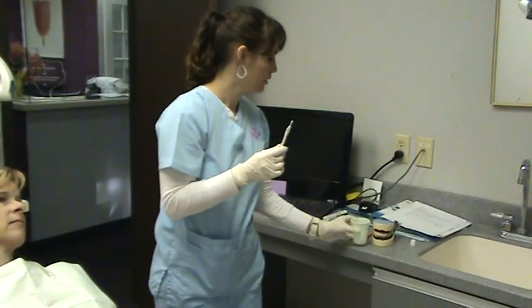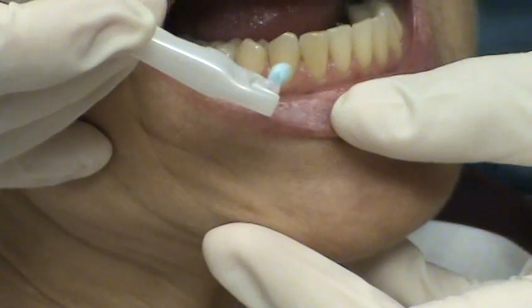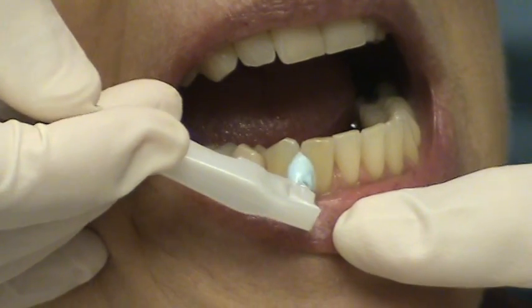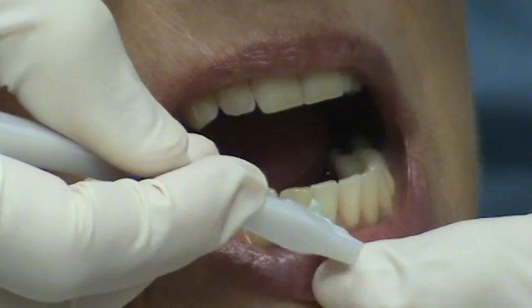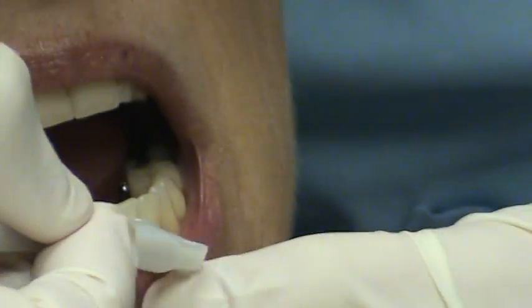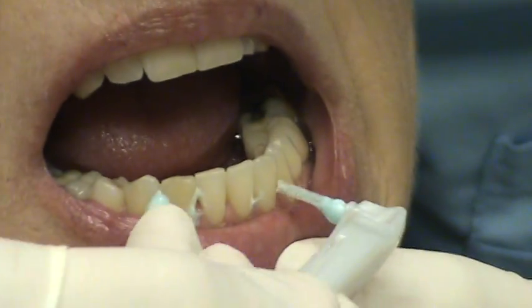Once you have your toothpaste, then you put it between the teeth and you use it like a scrubber. Scrub the plaque from between the spaces from the outside going in. If it doesn't fit, don't force it through — move on to the next spot. You do all the areas from the outside going in.